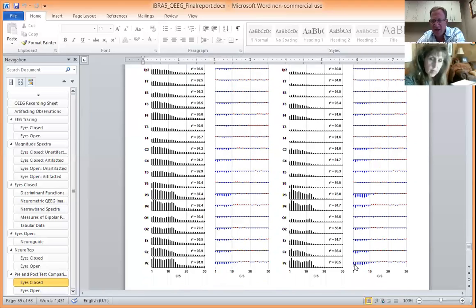When we look at it, we see PZ, CZ, P3, P4, and O2 as the greatest decreases. And I think P3 may be the only one where you have a sensor. So it is decreasing, but just not necessarily over the exact training sites.